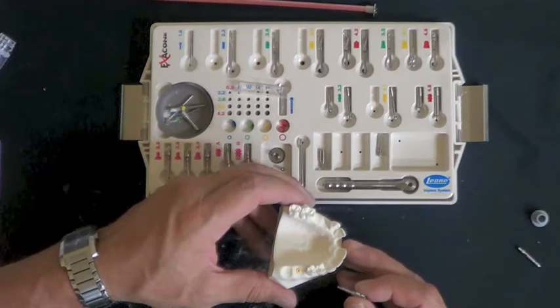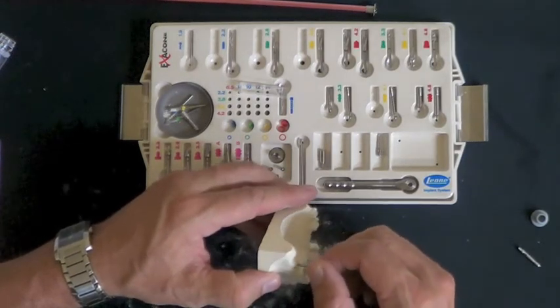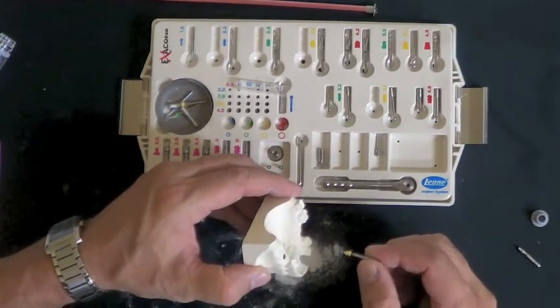When you do the second stage surgery, then, you simply remove that cover cap by inserting the same tool. Turn it a couple times clockwise to engage it and pull it out of the implant itself.